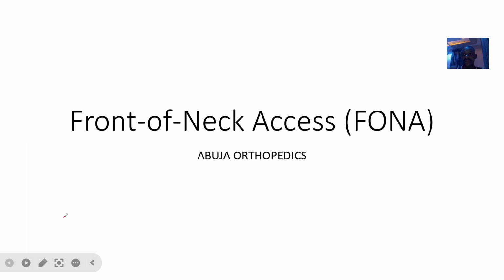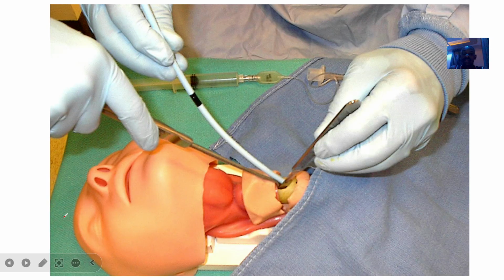So in talking about resuscitating patients, giving them oxygen, intubations and all of that, we've spoken about all of that, made a lot of sense out of it. But sometimes intubation can fail. You understand? So when intubation fails, you now need to go in for this last method, which is known as the FONA. That's the front of neck access. Okay? So front of neck access, you just have to do it.